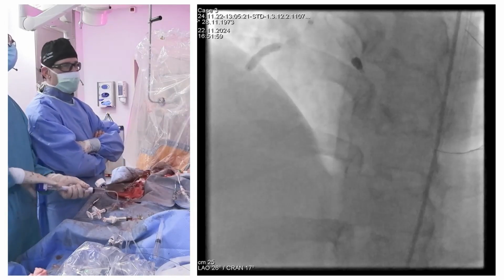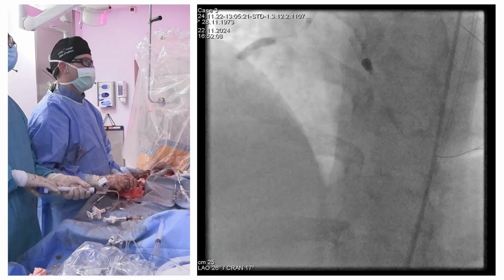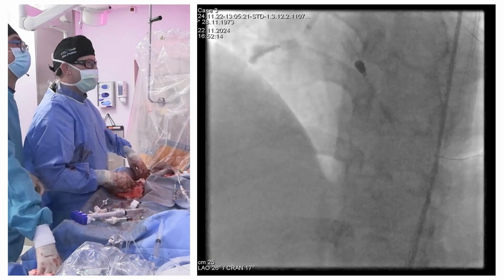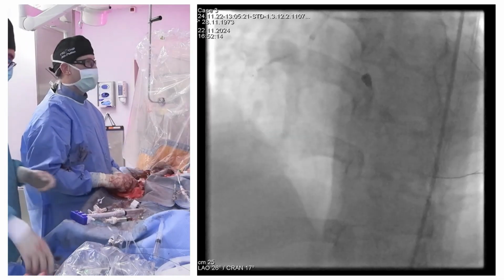And we see now, after we have good drug-eluting stents, that they are not as good as we thought. You have a yearly target lesion failure rate of 2%. It's just a foreign body reaction, and so we have to get rid of this stuff, yeah.